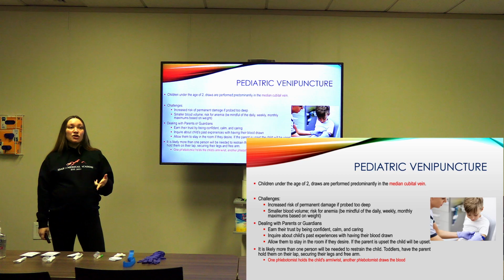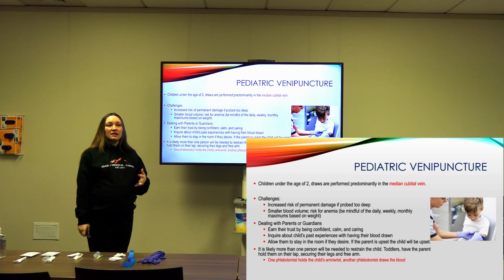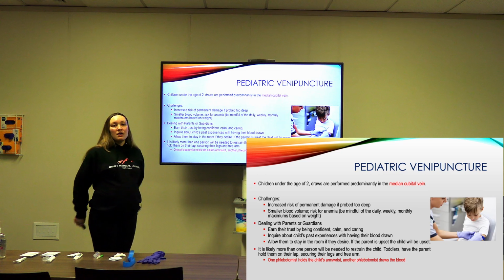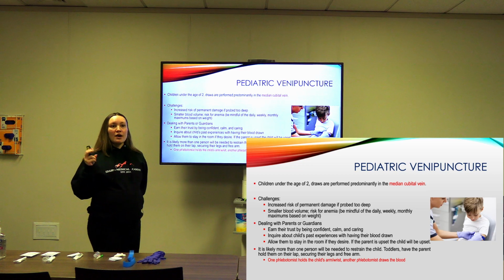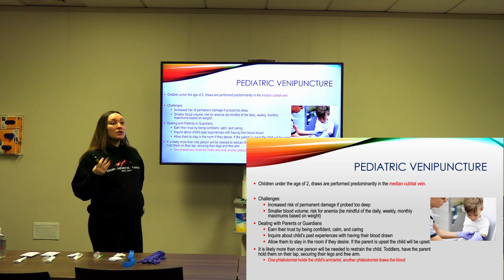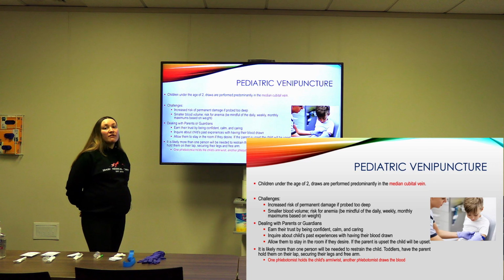If you come in and you are shy or you don't really act like you know what you're doing, they're going to ask you the uncomfy questions. How long have you been doing this? Do you have lots of experience with kids? They're going to ask you all these things and make the environment really uncomfortable for you. And then, sometimes they might request that someone else come. So just be calm, confident, and caring. Inquire about the child's past experiences with having their blood drawn.